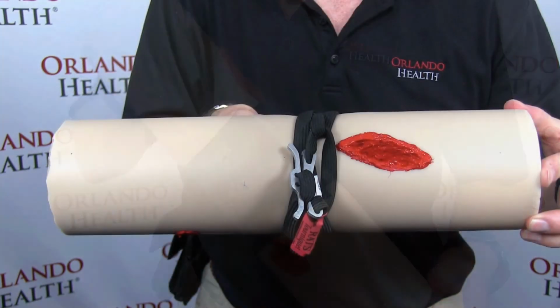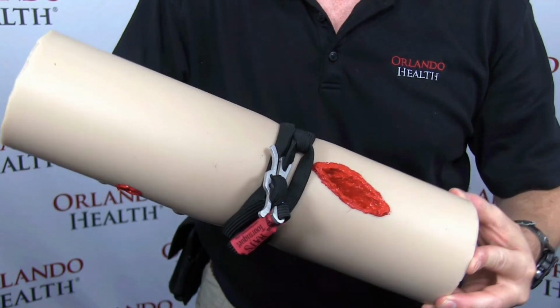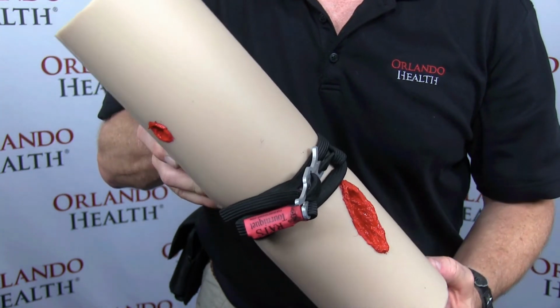The SWAT tourniquet, a long piece of elastic rubber, is also common and retails for around $12. The RATS tourniquet is another tourniquet to consider. It retails for around $17. All will help you to stop bleeding.